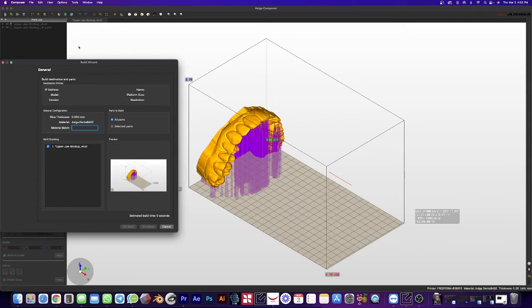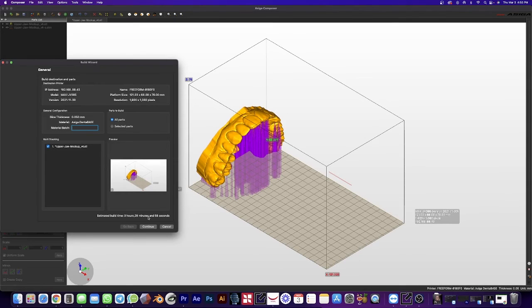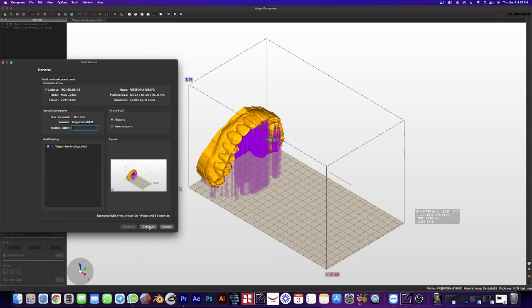And we can go ahead and send it to the printer, and it'll tell us the estimated build time. Just hit continue, and we can head over to the printer and start printing.